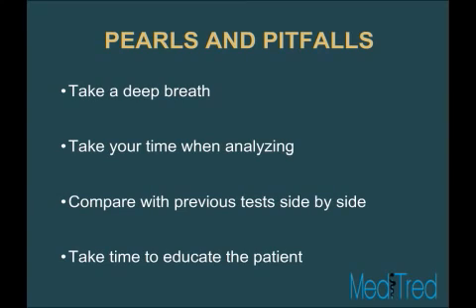And also some of the important points here from an educational standpoint is to realize that the patient is very nervous when coming in for their visual field. This is a high stressful visit for a lot of our patients, and taking time to educate them and informing them about some of the tricks they can use to get more comfortable while doing the visual field will go a long way.